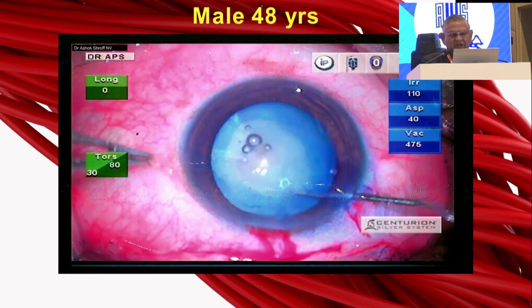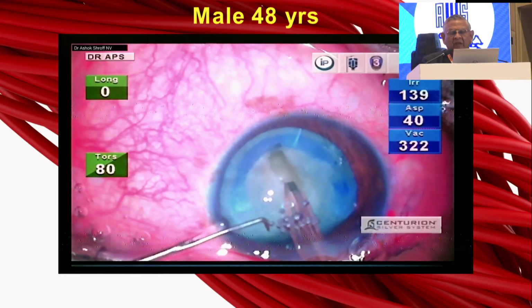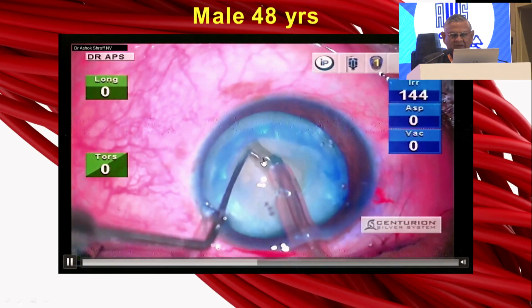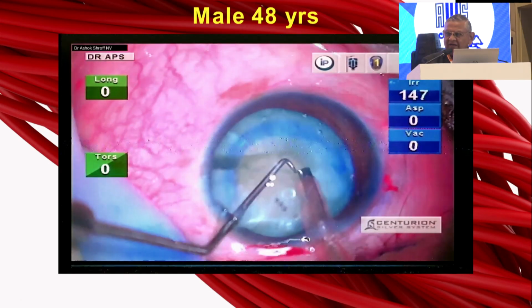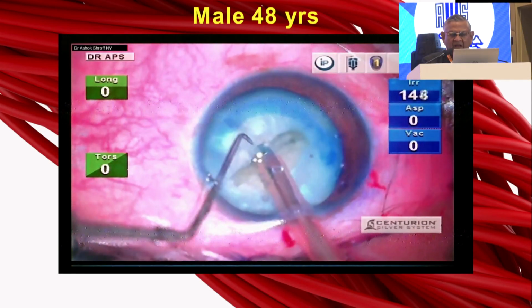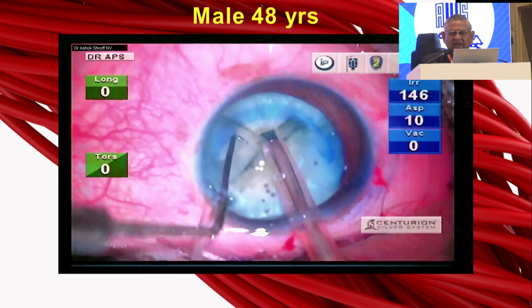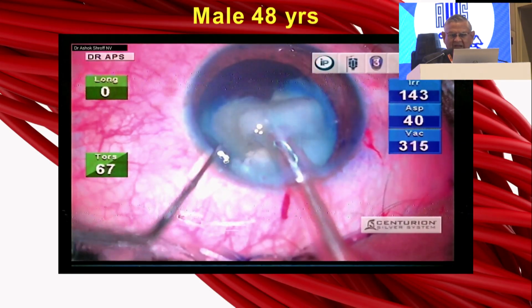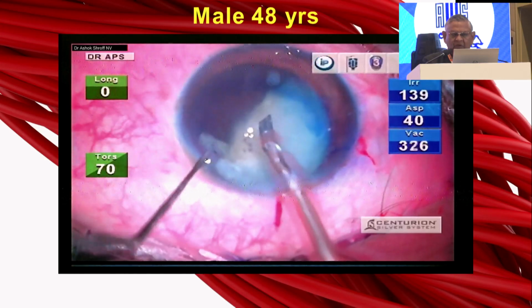you can rotate the nucleus, and it easily rotates. Then make a gutter, and with the sharp chopper, you can see here, it's easier because the cataract is a little soft. But you have to make sure that you don't cut or injure the rhexis margin. And then you bring the fragments into the center, do the phaco, and aspirate and remove the nucleus fragments.